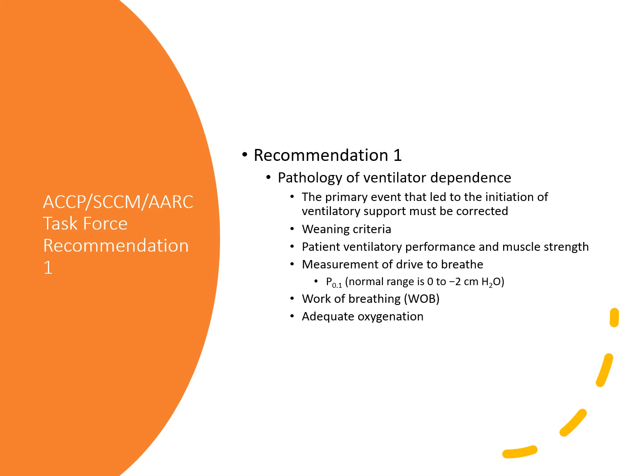So more than that, is it appropriate that if one is out of line that we not consider weaning? This one parameter is out of line, so we consider not weaning? No, by no means. So we have to look at the whole situation and approach it as a care team. So when we're trying to predict whether a patient's ready to be weaned or not, it can be a little difficult in some patients.